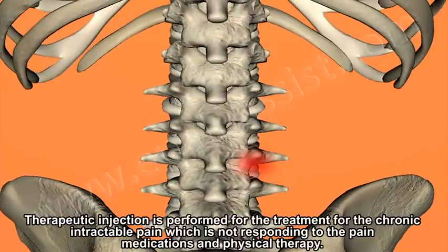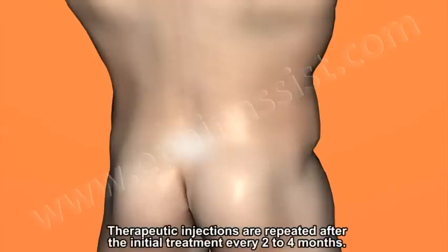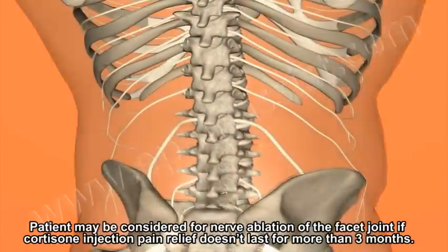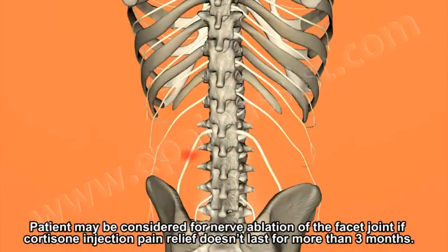Therapeutic injection is performed for the treatment of chronic intractable pain which is not responding to pain medications and physical therapy. Therapeutic injections are repeated after the initial treatment every 2 to 4 months. Patient may be considered for nerve ablation of the facet joint if the cortisone injection pain relief does not last for more than 3 months.